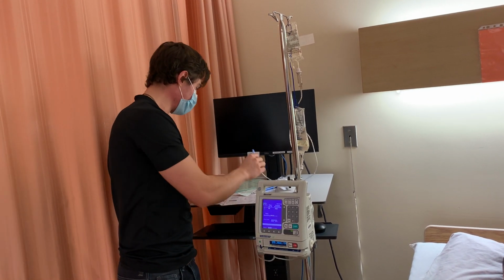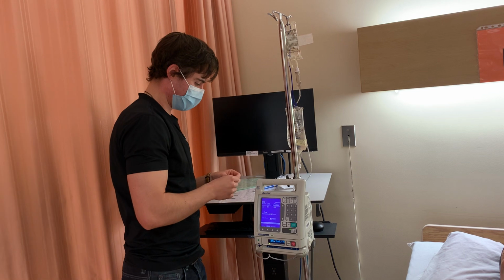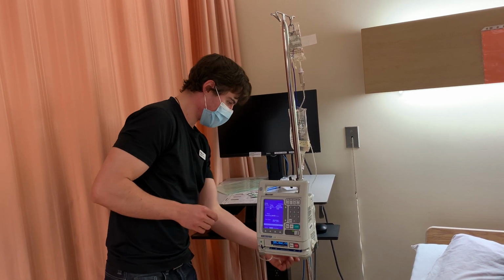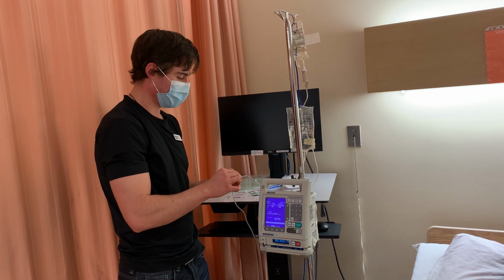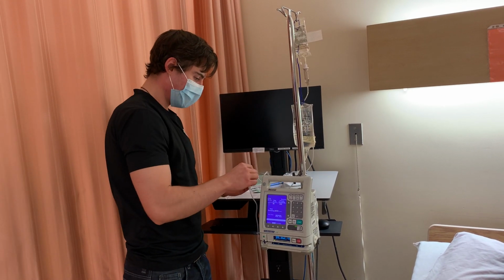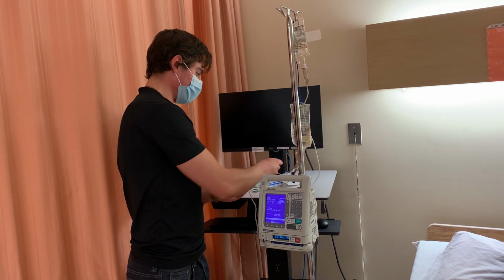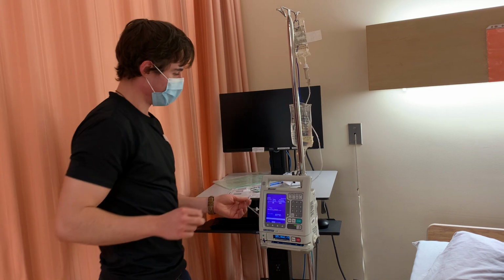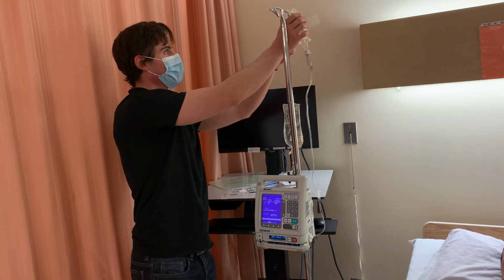I'm then going to use an alcohol swab on the port for 30 seconds, the port above the Baxter pump. And then I'm going to connect that up.